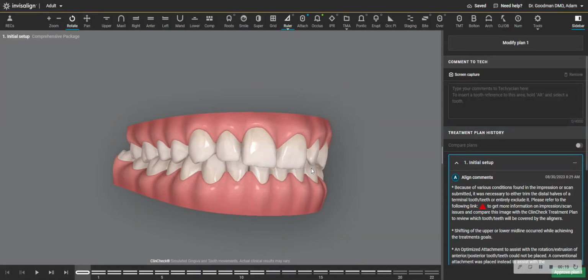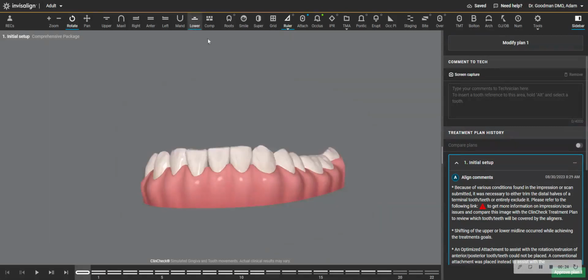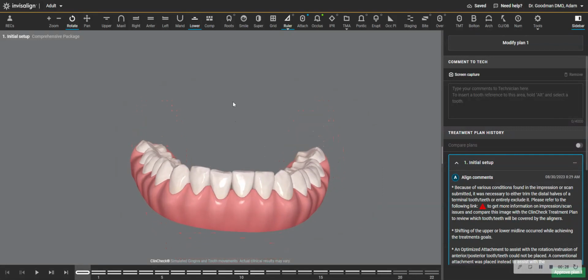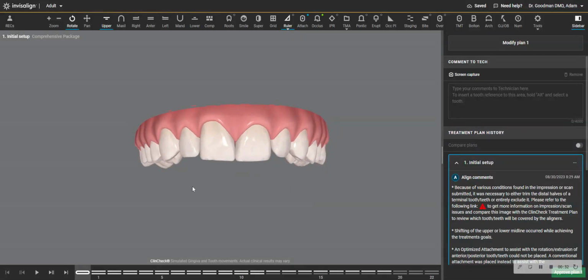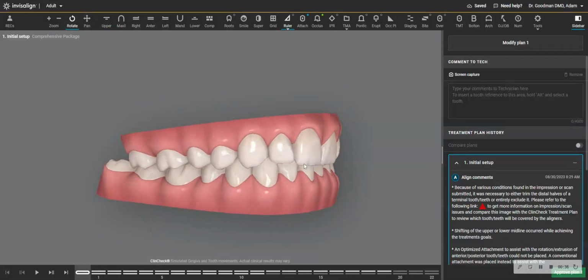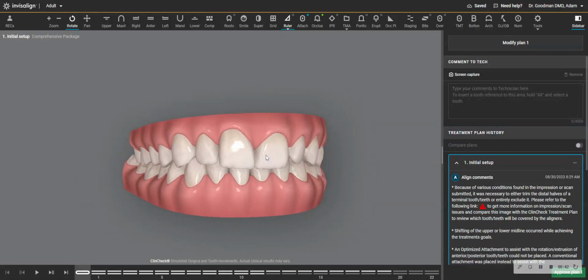Here's a patient, class 1 bilaterally. There is crowding top and bottom. And you can see there is also some considerable wear. This woman is in her 20s and already she has a lot of wear. Her chief complaint is that she doesn't like that her teeth go in, and she wants to have her teeth kind of lean forward more, be more prominent.